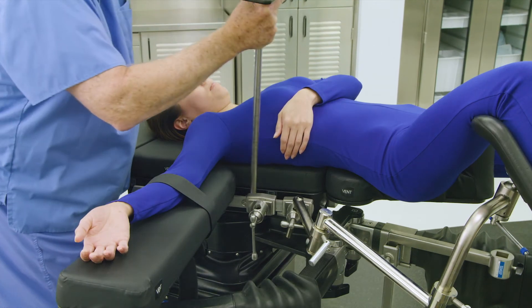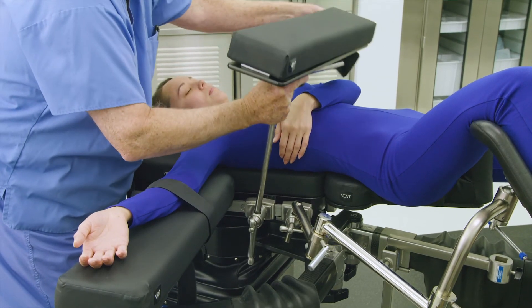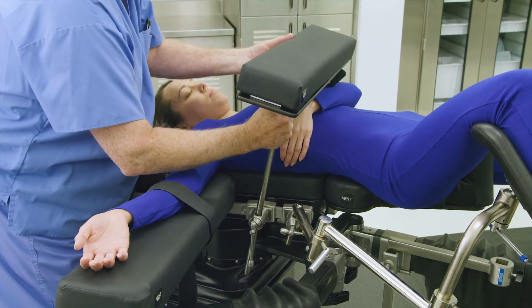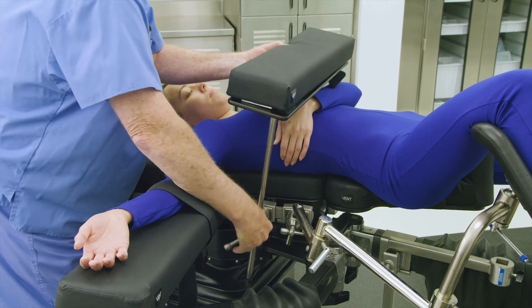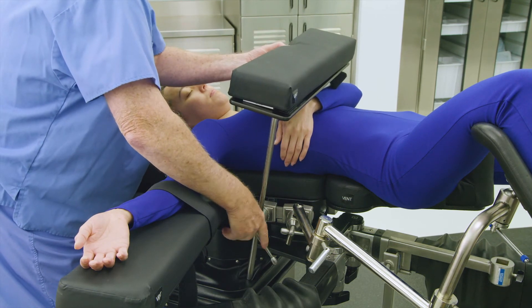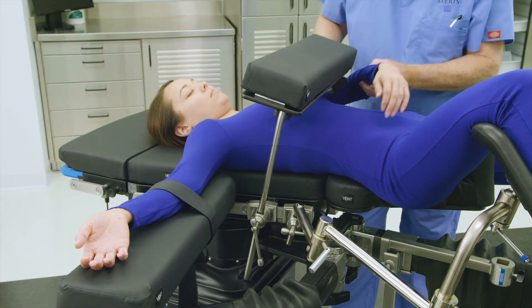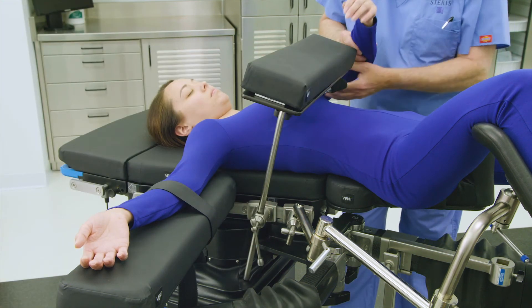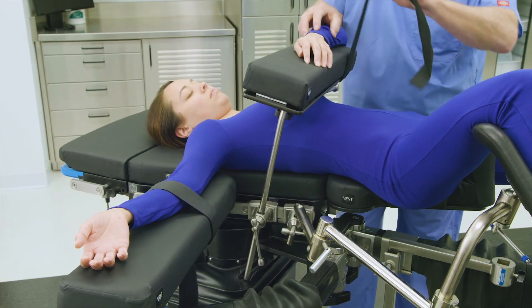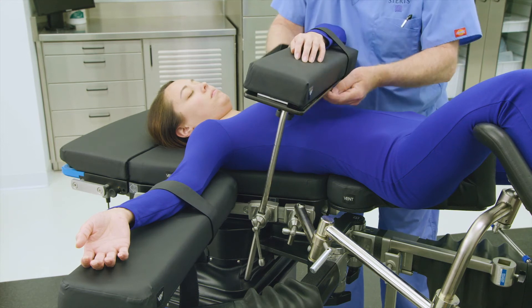Next, mount the multi-position armboard into the socket clamp. Adjust the height and position of the armboard above the patient's torso and tighten the socket clamp to secure. Place the patient's operative side arm into the multi-position armboard and apply the safety strap to secure the arm.